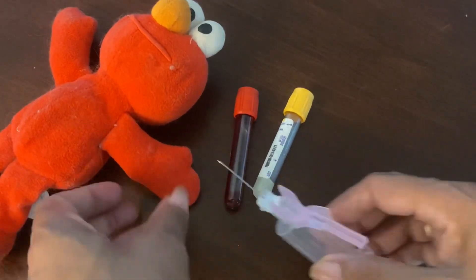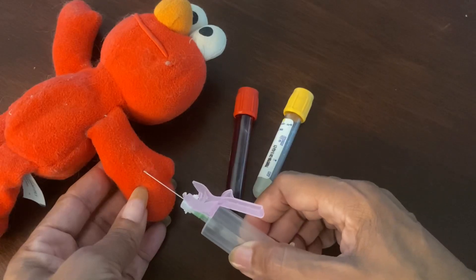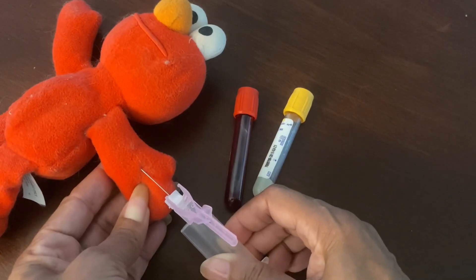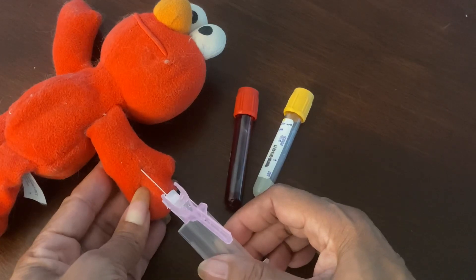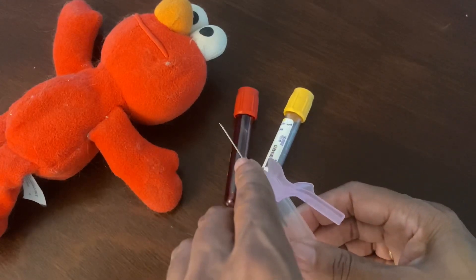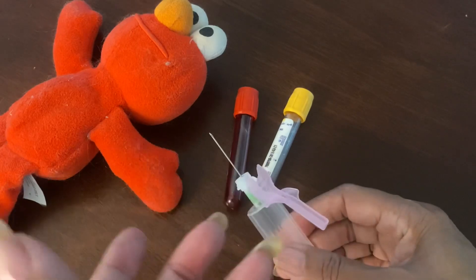Now when veins sit really deep, the thing is you know where the vein sits. So you go slightly below it — you go in because you're still on that vein, it's just a deep vein. So once you're in, then you have the ability to adjust your needle and go in until you puncture it. That's the beauty of a straight needle. Look at all this needle — all of this may not end up in the arm and the vein, but it's leverage.